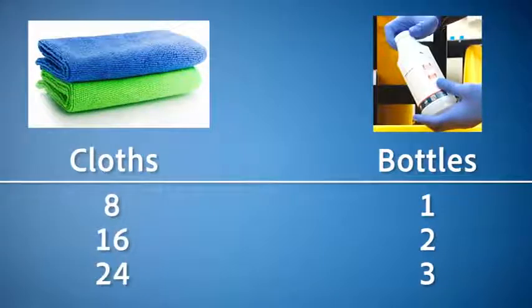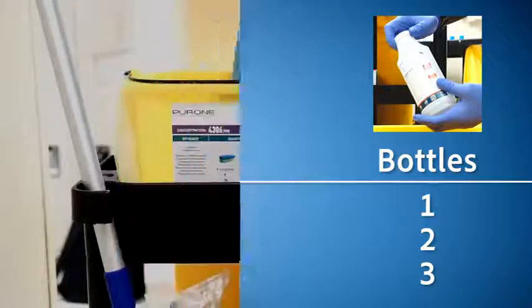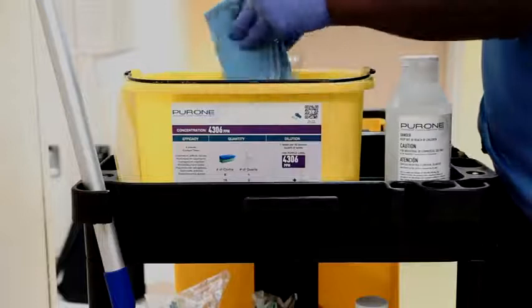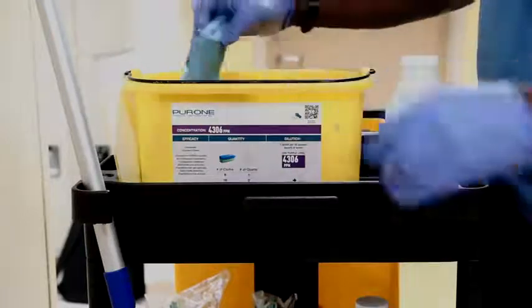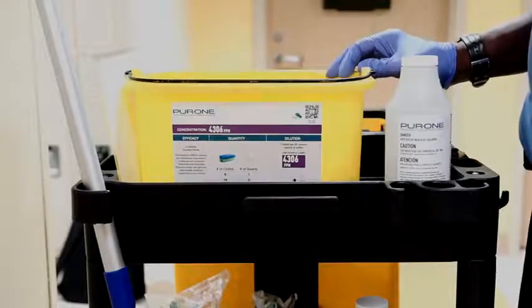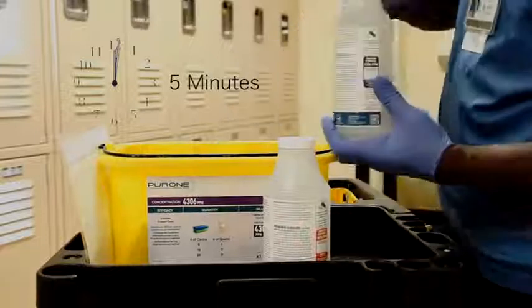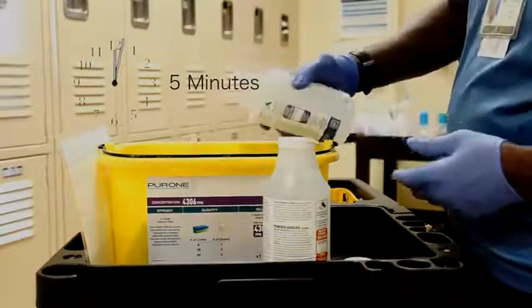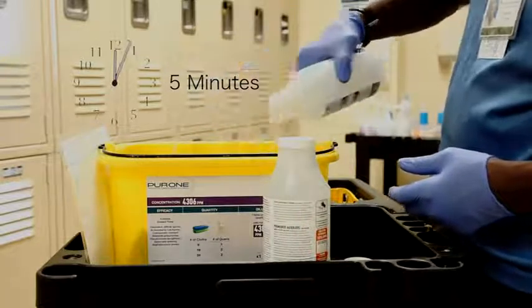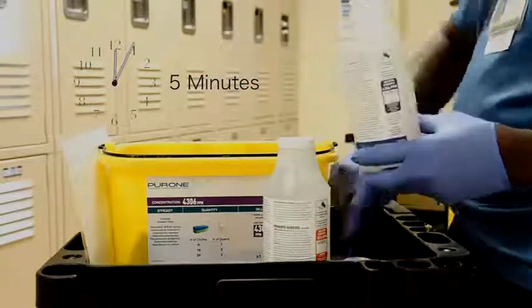Determine the number of microfiber cloths you will need for your shift to properly charge the microfiber cloths. Prior to placing cloths in the bucket, ensure that you properly fold each cloth in half, then fold it in half again to have 8 sides to clean with and for optimal saturation. Place the appropriate number of microfiber cloths in the bucket, and then pour the needed amount of solution evenly over the top. Allow at least 5 minutes for saturation prior to using.